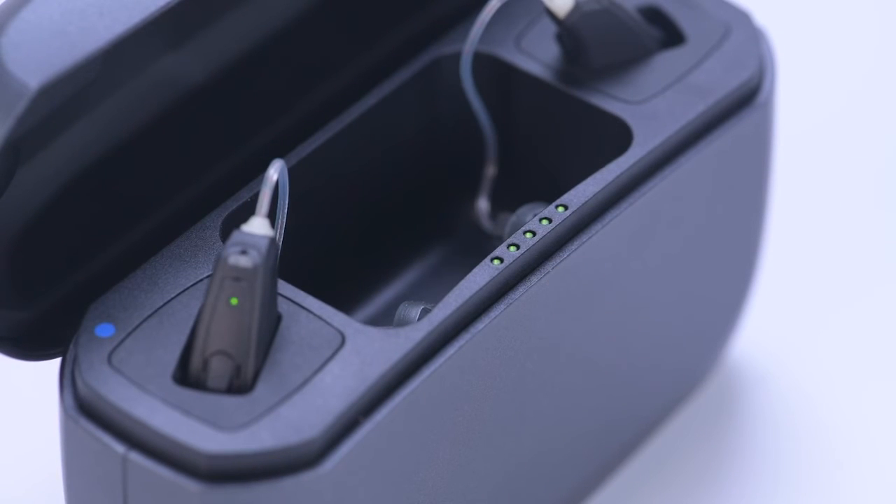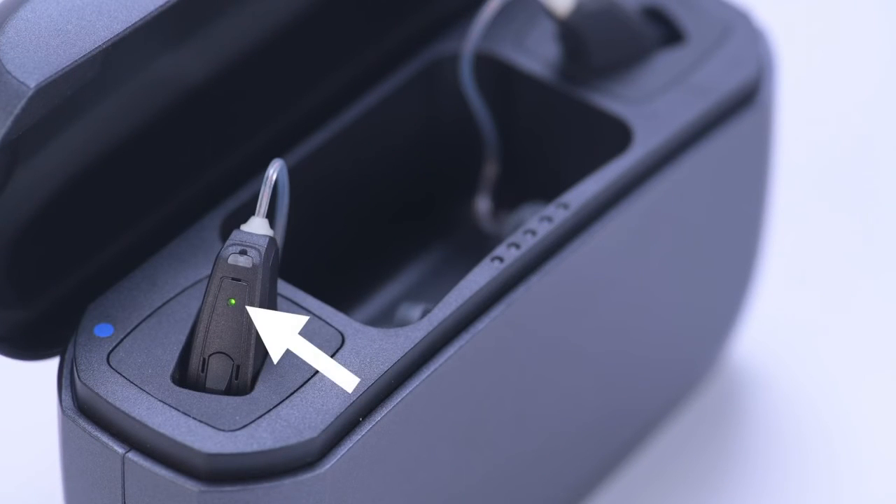The LED lights on the hearing aids will continue to illuminate throughout the charging process, and will remain solid on when fully charged. Charging completion takes approximately 3 hours for hearing aids with 0% battery.